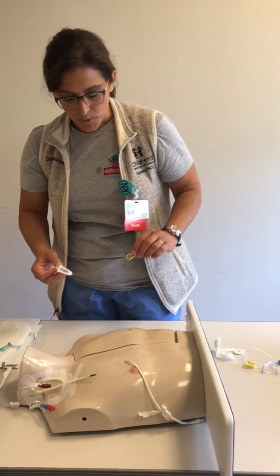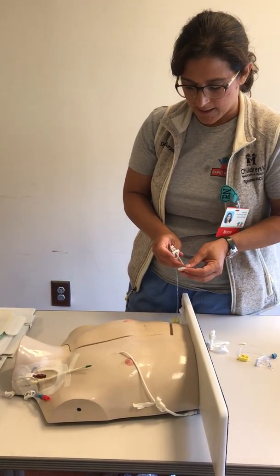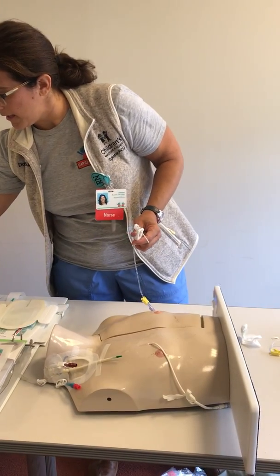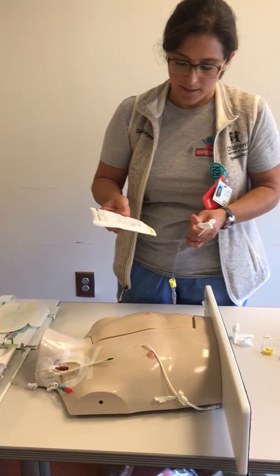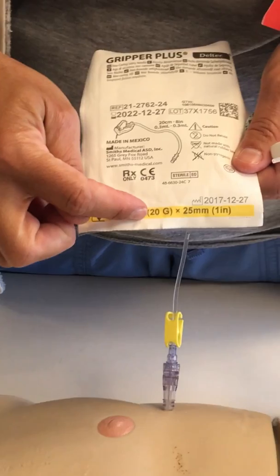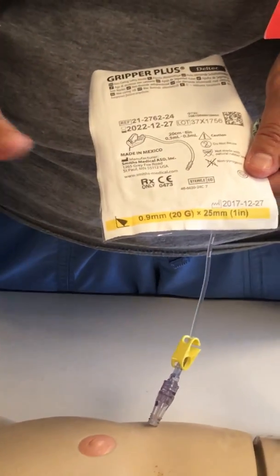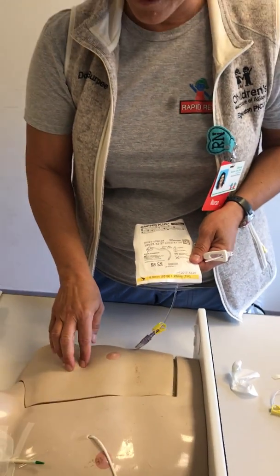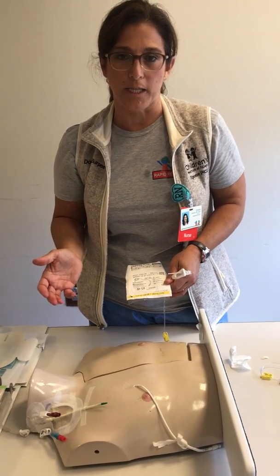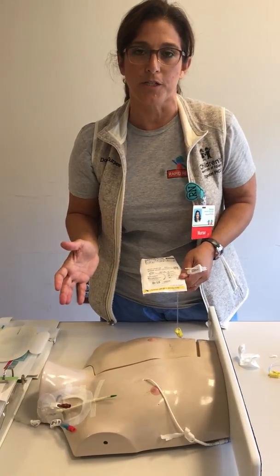When we re-access, we look at the size. For the gauge, we want to pretty much use 19 to 20 gauge needles. The reason is that a lot of these kids are coming in and needing a lot of blood taken from them. If we put a smaller needle in, we could possibly clog this port, and we don't want to do that. So as a standard, try to use a 19 or 20.